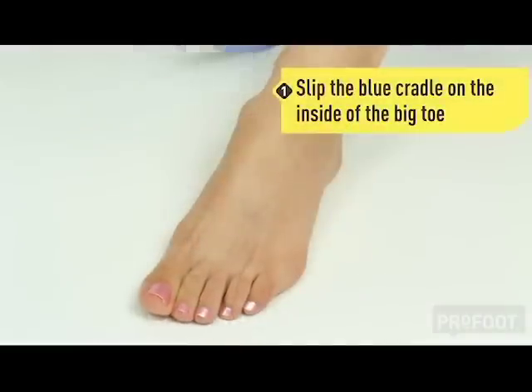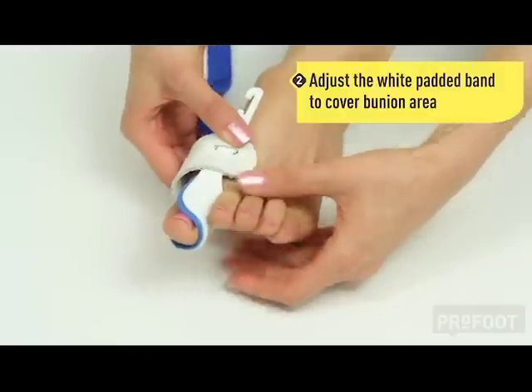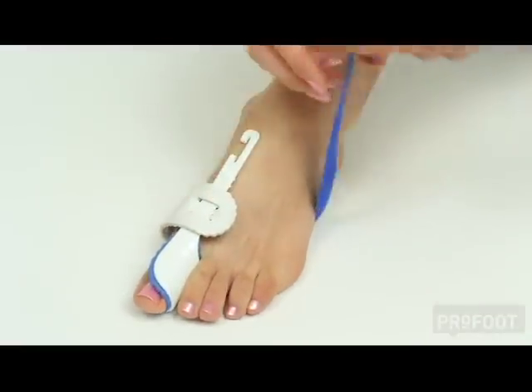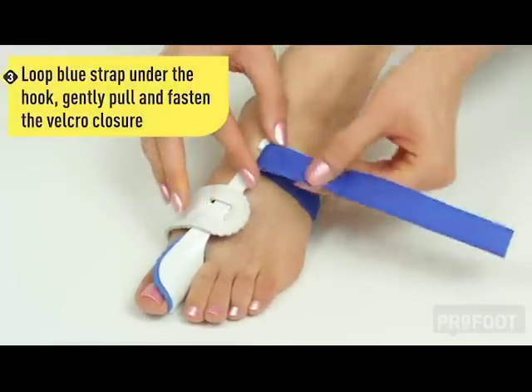Gently slip the blue cradle on the inside of your big toe and adjust the white padded band to cover the bunion area. The strap will be on the bottom of the foot. Wrap it around the outside of the foot, loop under the hook.